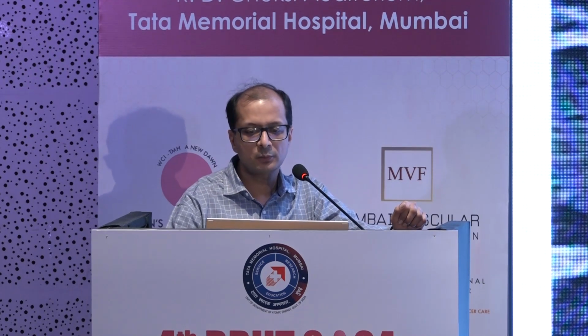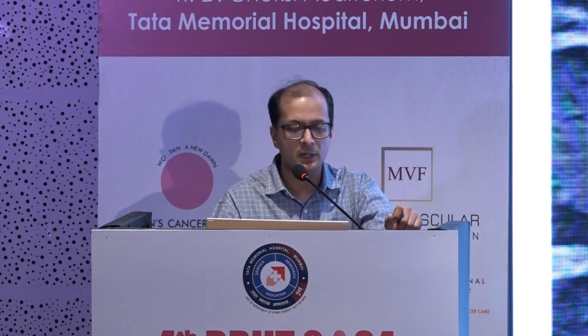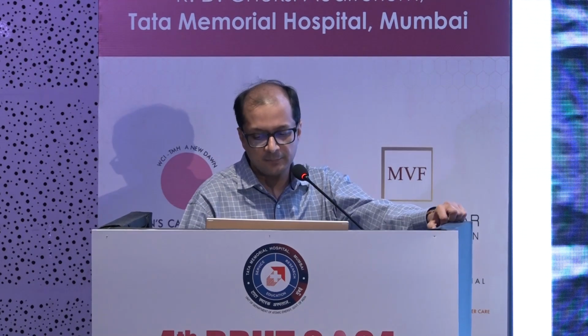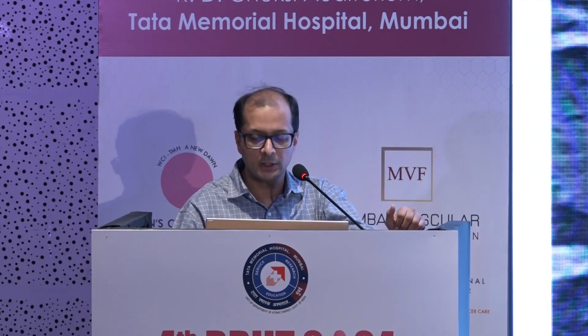And on ultrasound, it was a 5 millimeter lesion, probably with lobulated margins. So probably BI-RADS 4A type of lesion. Since it's not visualized on CEM, maybe I would downsize to BI-RADS 3 or maybe 4A type of lesion.